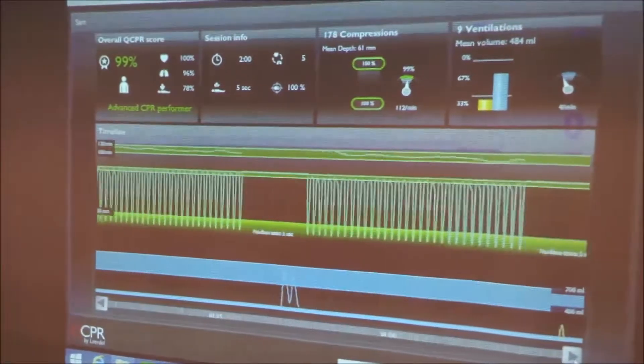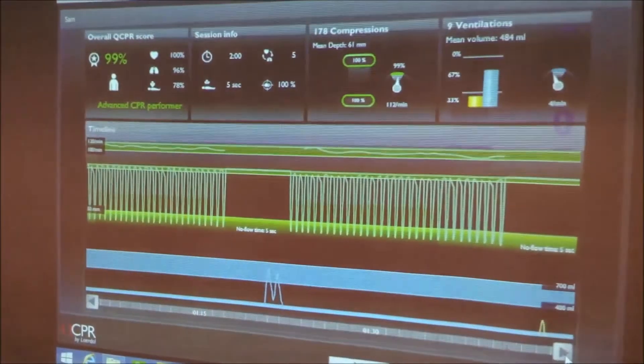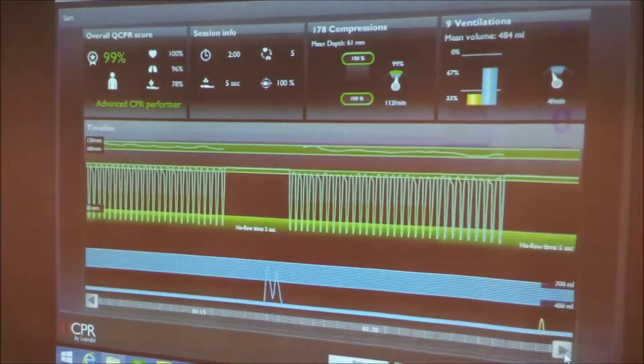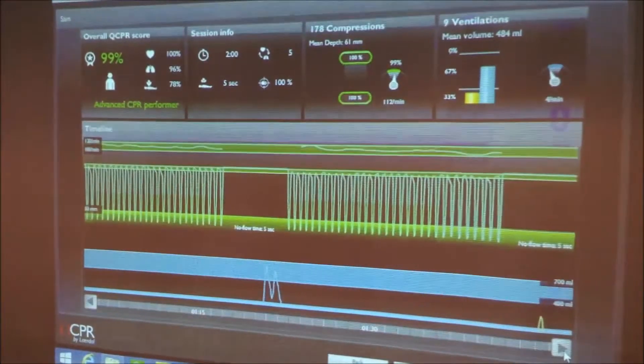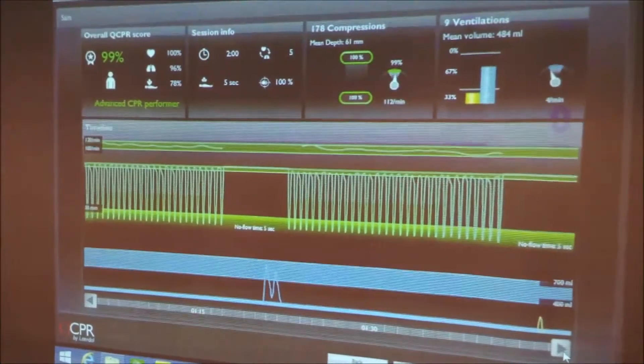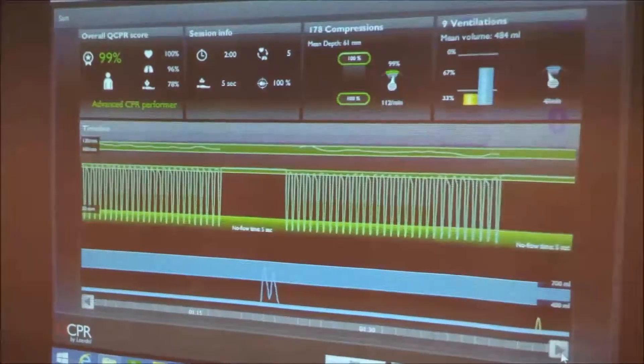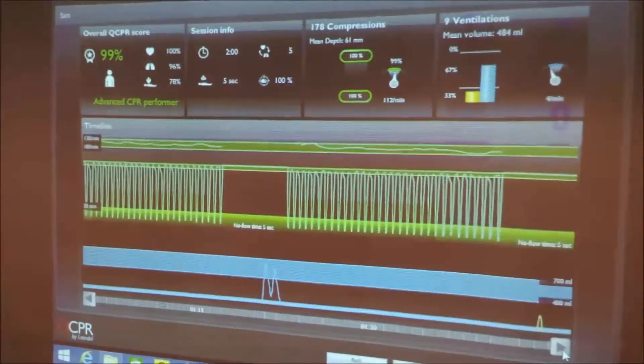In fact, in some occasions, this person is achieving a no flow time of 4 seconds. That's the time going from the chest to ventilating to being back on the chest again.